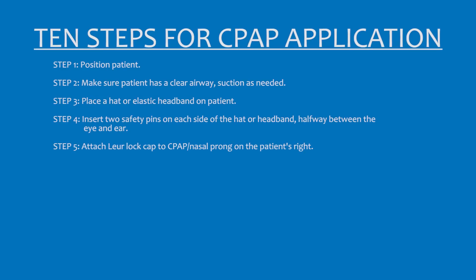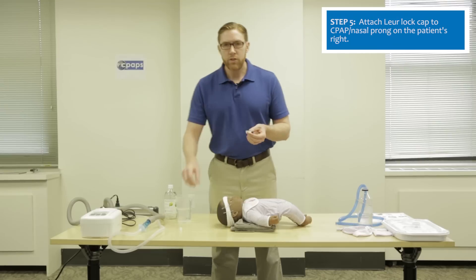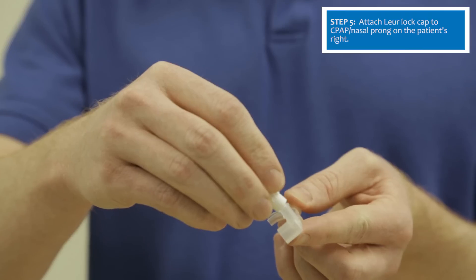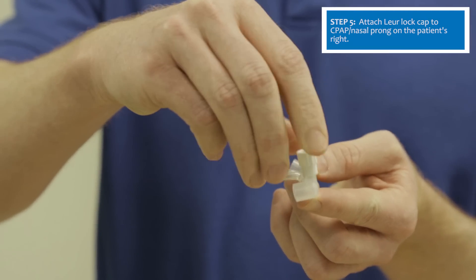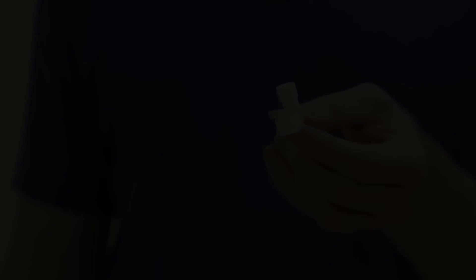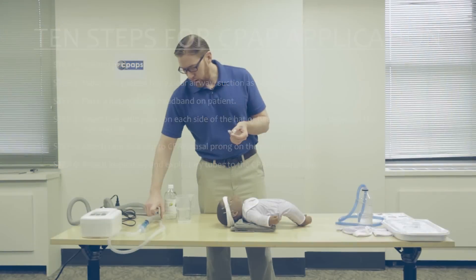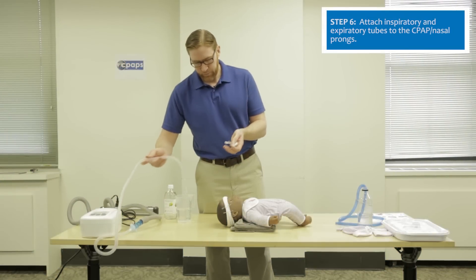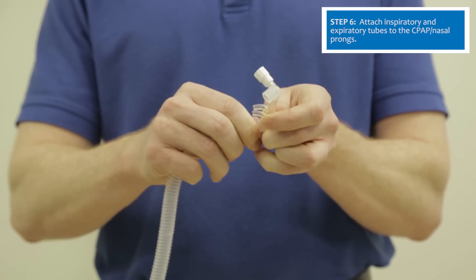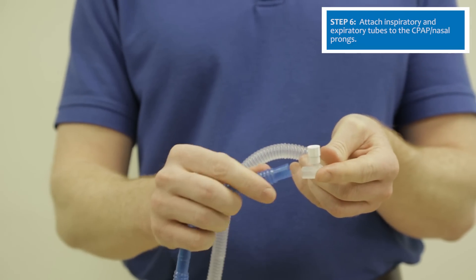Place another two safety pins on the patient's other side. Then prepare the CPAP prongs. When the CPAP prongs come, there is an opening in the circuit — use a lure lock to close that circuit by placing it onto the right side of the CPAP prongs. Then attach the tubing to the prongs: the inspiratory tubing goes to the left side of the prongs and the expiratory tubing to the patient's right side.